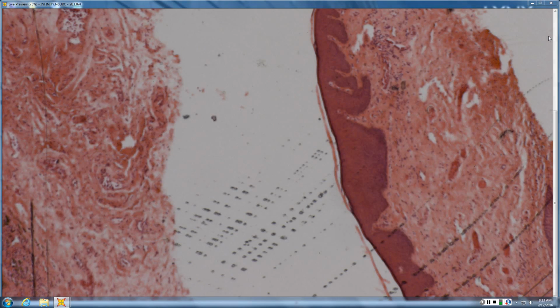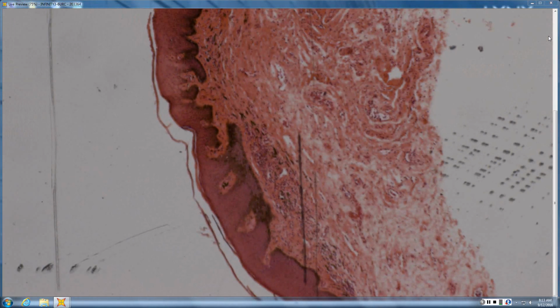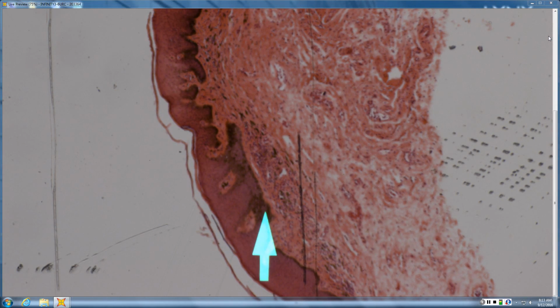So pretty broad acanthosis with basal hyperpigmentation. Looks pretty good for like a nasal melanotic macule. Yeah, so it looks like a melanotic macule, pretty broad, almost boxcar-like hyperpigmentation, pigment confined to the basal layer. One of the hints is you have a vascularized submucosa, lots of vessels, lots of nerve, delicate collagen. It's not a bundled reticular dermis, so you're on a mucosal area, not on skin.